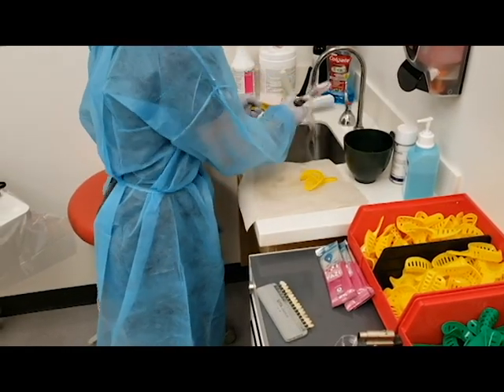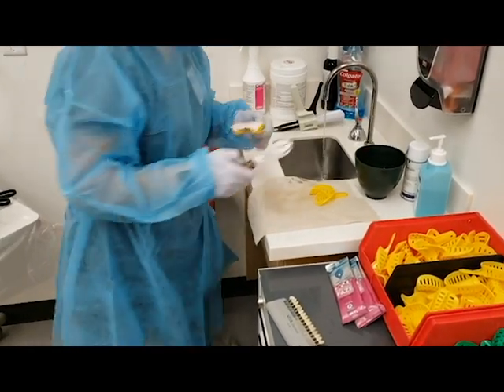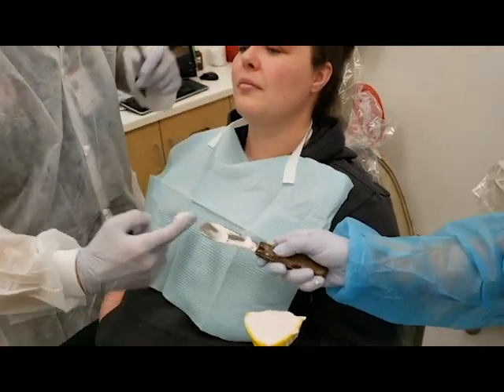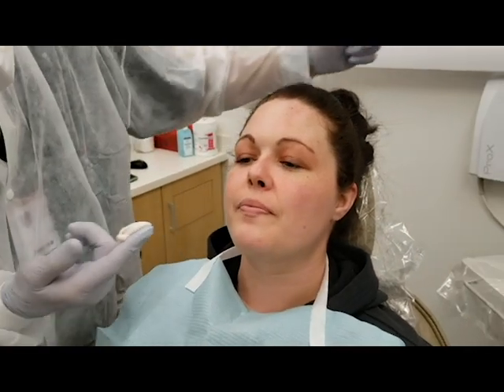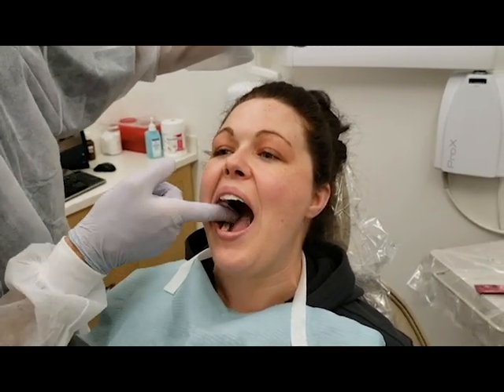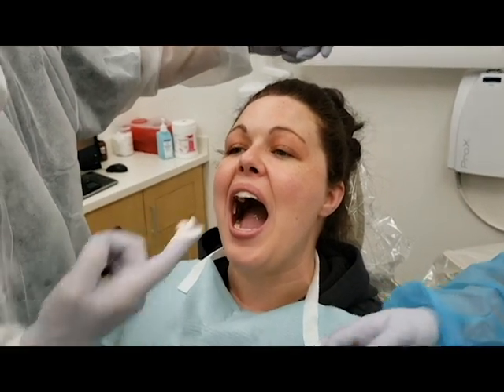Okay, here we go. I like to take a little bit of this excess and wipe it into the occlusal surfaces. I'll need just a little bit more.